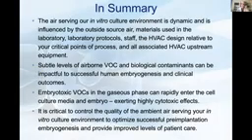So in summary, we've learned through decades of work, and again, none of this would have happened without the pioneering work of so many, including Jacques Cohen, Antonia, Tim Schimmel, Jerry Hall, Dean Mortimer, Morbeck, countless critical studies and publications that really started and helped guide this field. But the air serving our culture environment is exceptionally dynamic, and it's influenced by outside source air, materials used in the lab, protocols, staff, your own HVAC system.